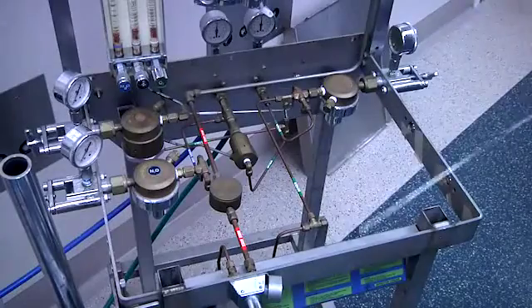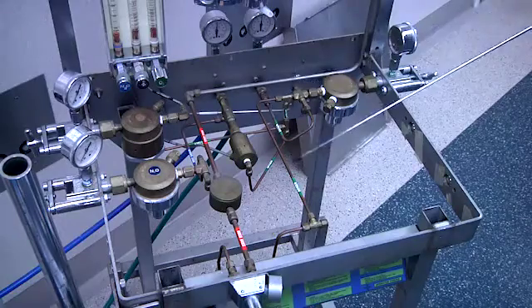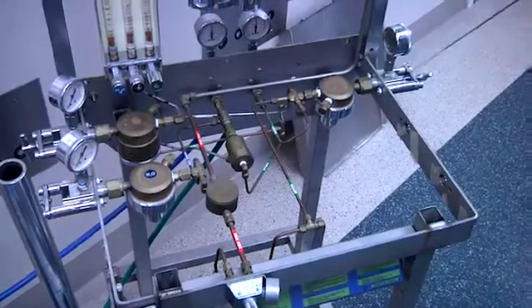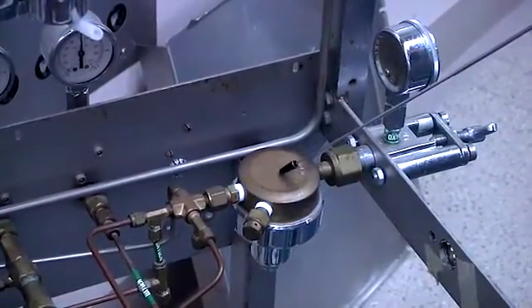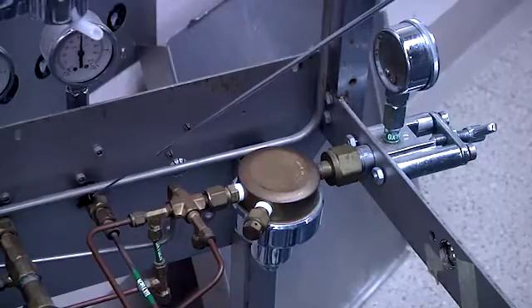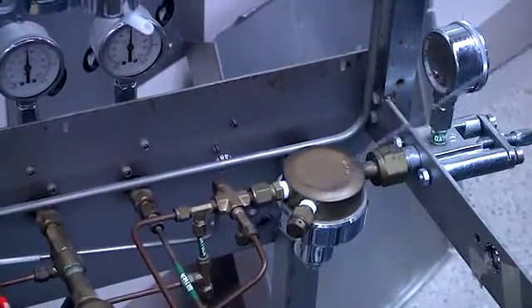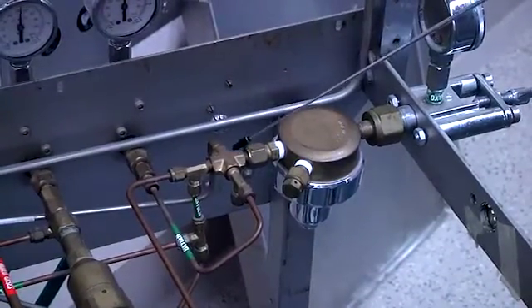If we take the top off of the machine, we can see the internal piping system. This was very similar to machines until a few years ago when they developed electronic mixing. Starting with the oxygen tank, which can be up to 2,000 psi, there is a reducing valve that reduces that pressure down to 45 psi. The wall oxygen comes in and joins the tank pressure. Wall oxygen is at 50 psi, so you would preferentially use the wall oxygen over your tank pressure.